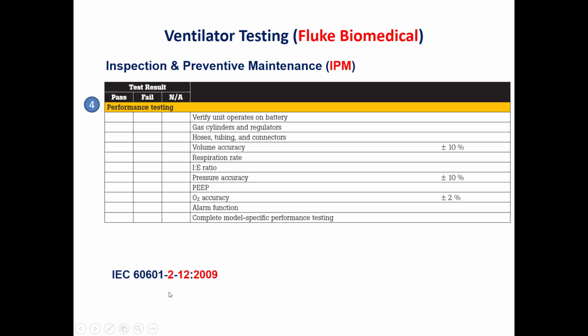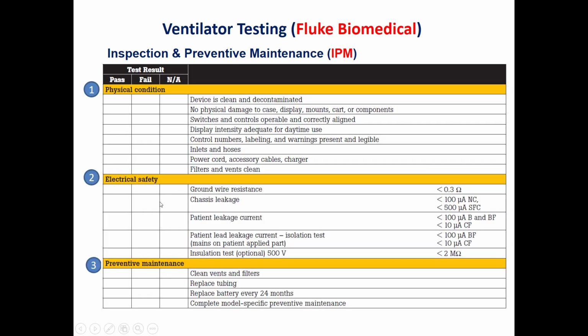For example, if it's IEC, this will be IEC 60601-2-12 2009. Similarly, the electrical safety should be done based on IEC 60601-1.